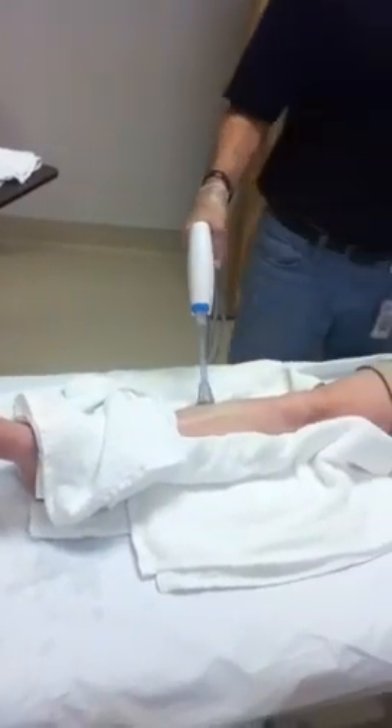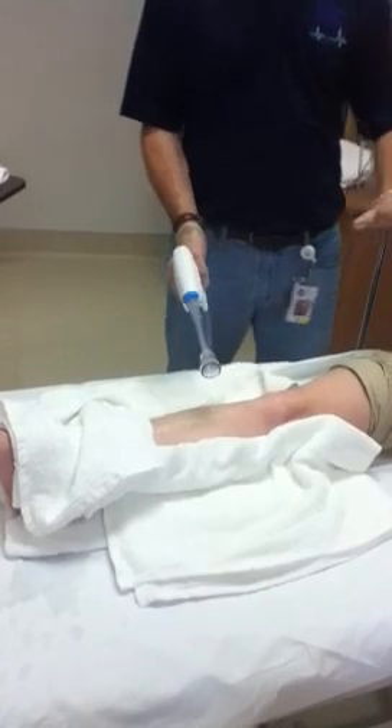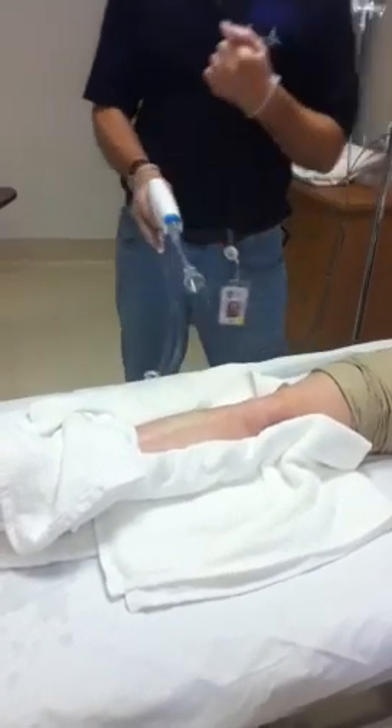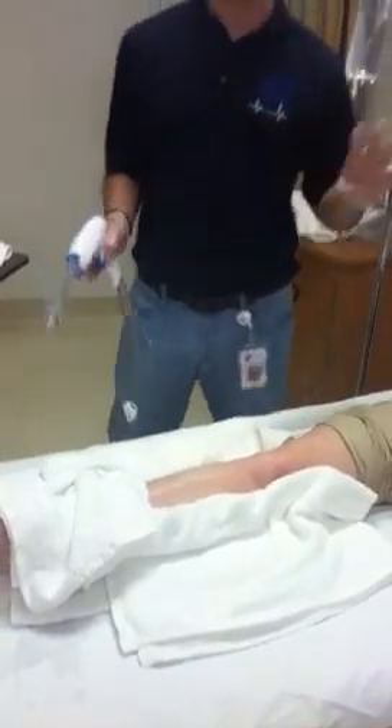I usually don't have the patient watch — I'll usually lay them down. I may even put a towel on them. I've had clinicians who will give the patient a mask. If you're going to be watching, offer them a pair of goggles. You go to the dentist now and they give you goggles because they're shooting water in your mouth and it's coming back out. So it would be appropriate to give her a pair of goggles to protect her from her own wound fluid. Not quite as gross, but still pretty gross.